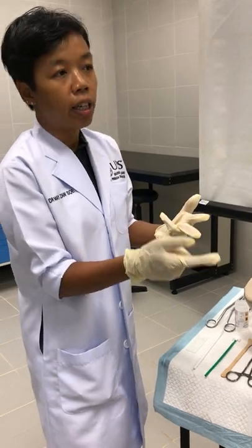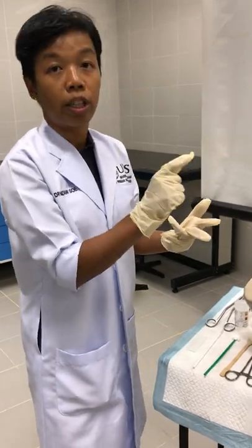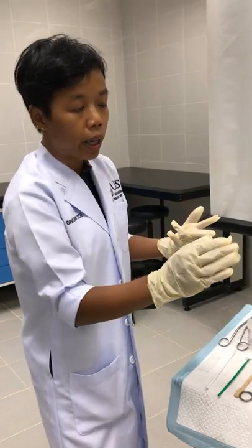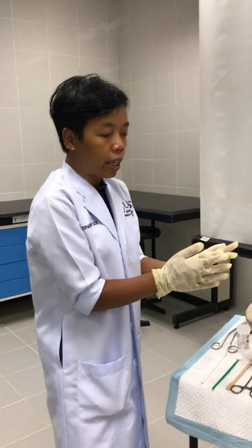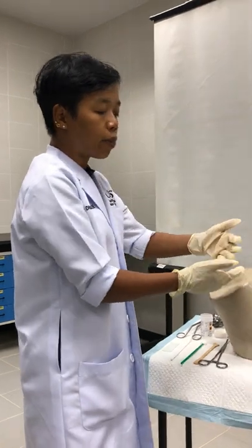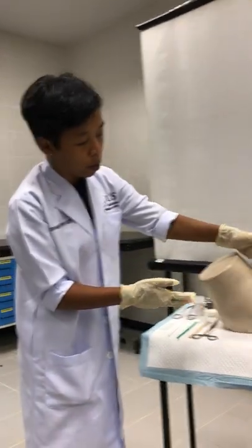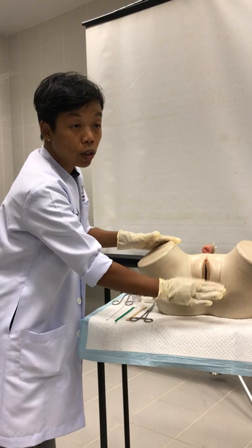The room has to be a private room and there must be a chaperone. Even though you are a female and the patient is female, and a female doctor is taking the pap smear from a female patient, you definitely need a chaperone — the chaperone must be female. The lighting has to be adequate, and if needed you can get a standing lamp so that you can see inside the cervix.